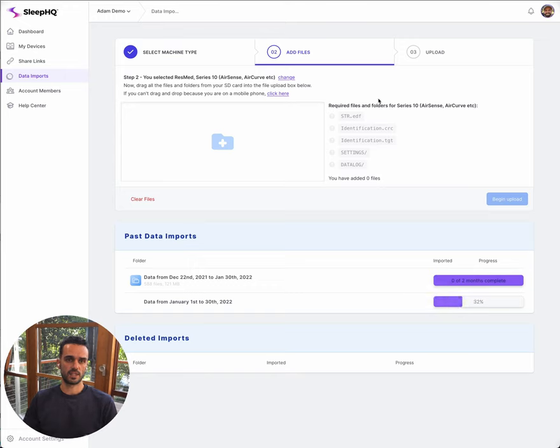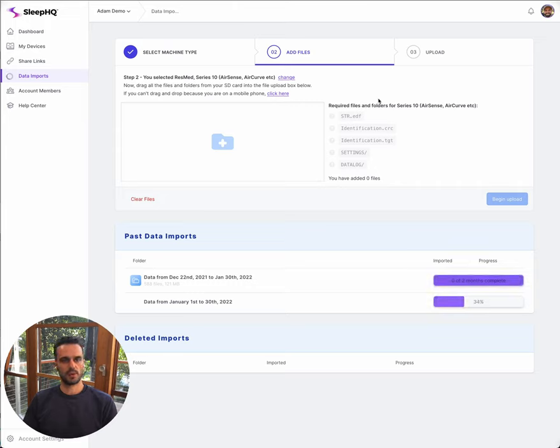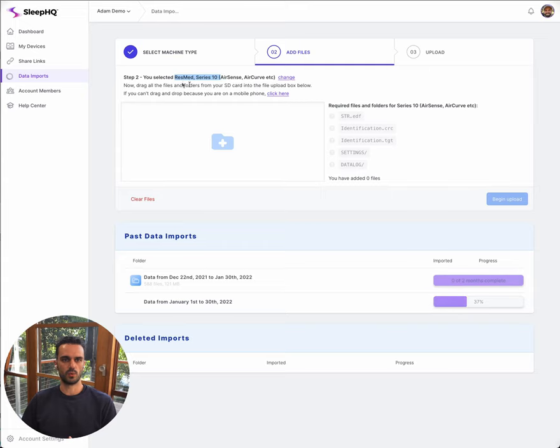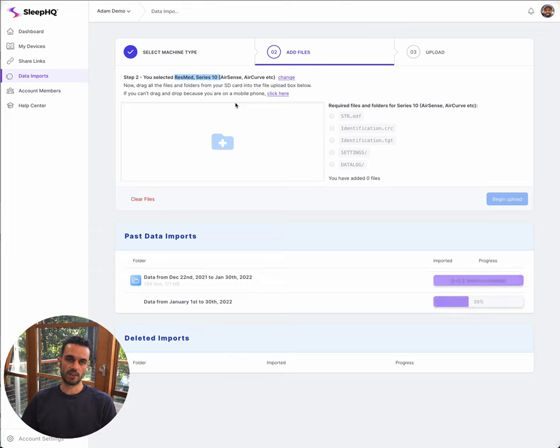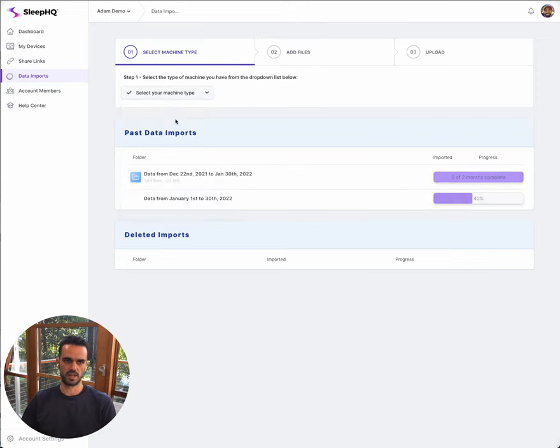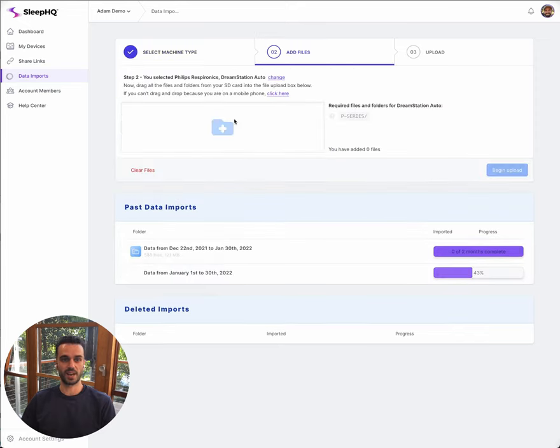One last point: if you've got different machines and you're uploading data from a different type of machine, once you've uploaded data from one type of machine the system is going to remember that and automatically drop you back into this page. It's remembered that my last import was from a ResMed Series 10 machine. If I'm uploading data from a different machine though, all I need to do is click this change button and it's going to take me back to step one where I can select, maybe say I've got a DreamStation machine at my holiday house, and now I'm going to upload some data from a different machine.